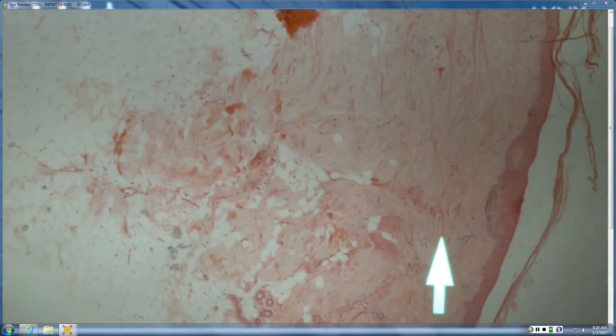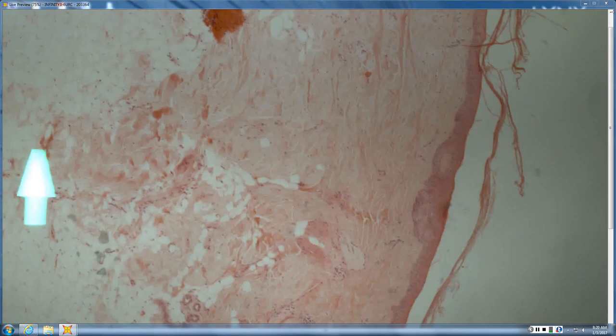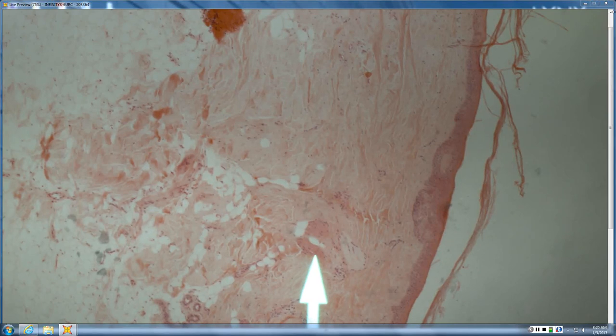Looks better up on the screen, yeah. So first off, there's not a lot of hair. There's a lot of scar, there's scar in the trap. And there are a lot of erector pili muscles, but not a lot of hair. And so with orphaned erector pili, are sebaceous glands present or absent?